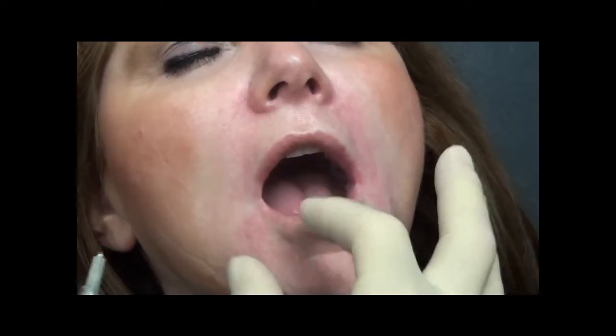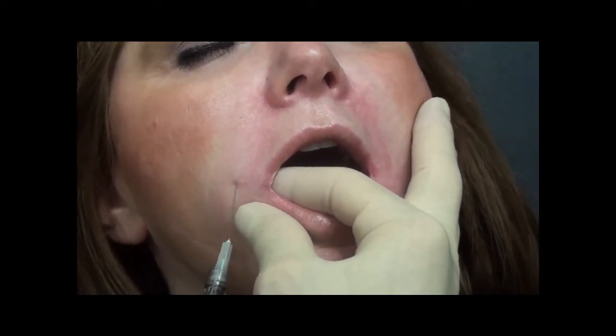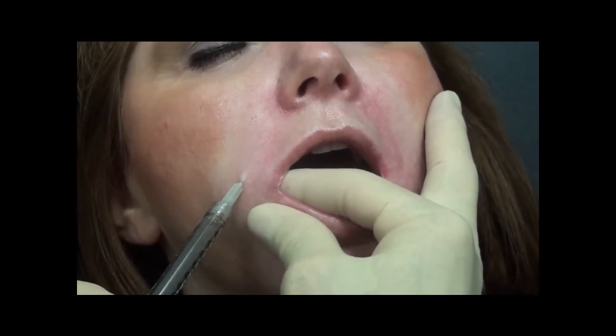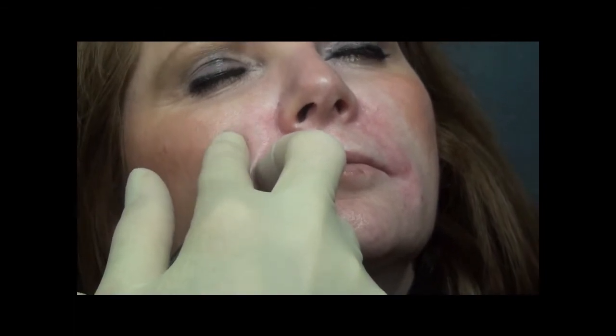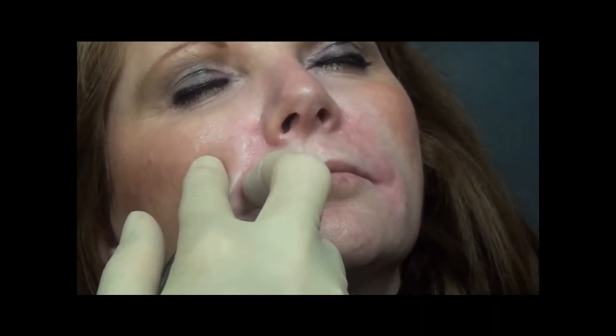We will now inject her right nasolabial fold. Open your mouth real big, Julie. We will insert the needle very superficially into the papillary dermis. There you can see the outline of the needle as it ascends to the superior portion of her nasolabial fold. When I reach the hub of the needle I will have her close her mouth, and that allows me to further advance to the superior portion of her fold. You will feel the injection start right now, Julie. There you start to see the wheal of material as the material makes its way in a retrograde fashion.